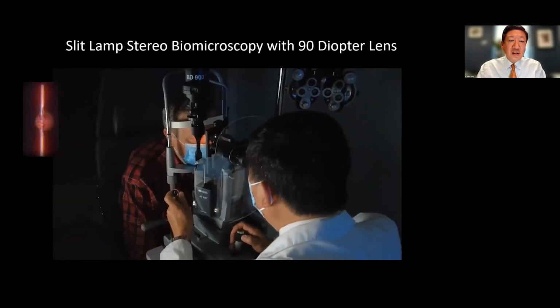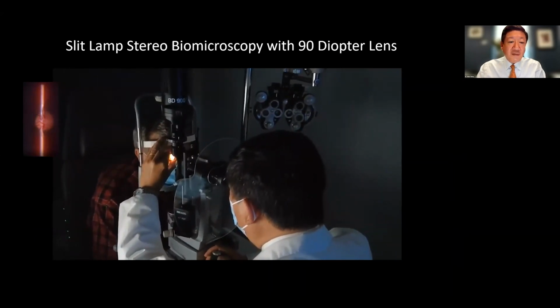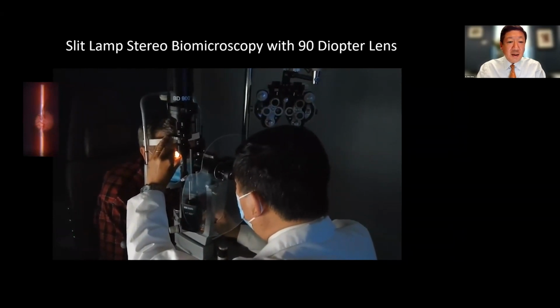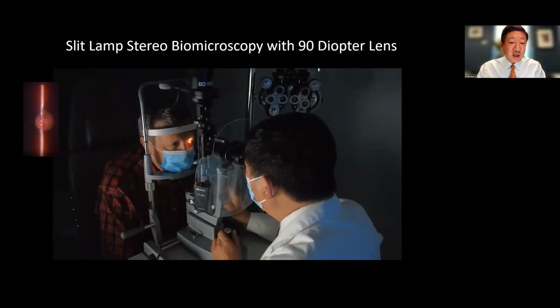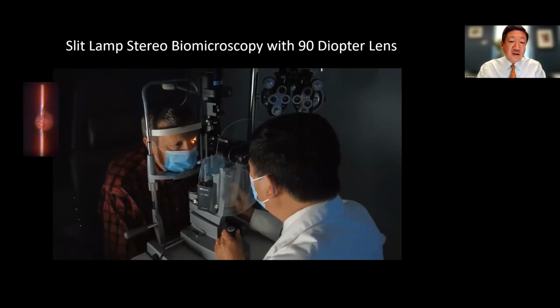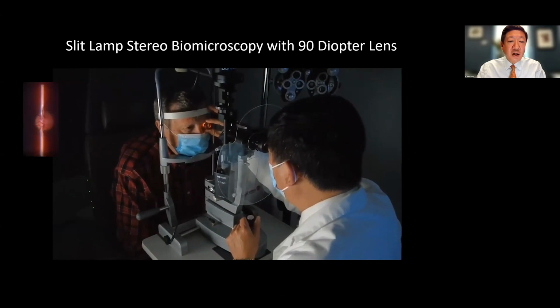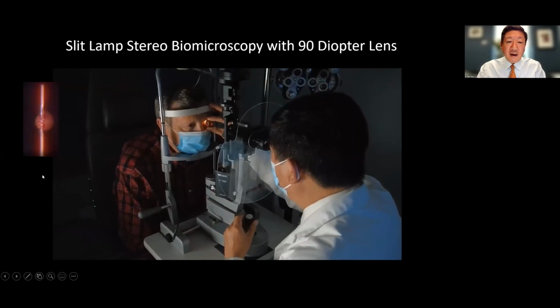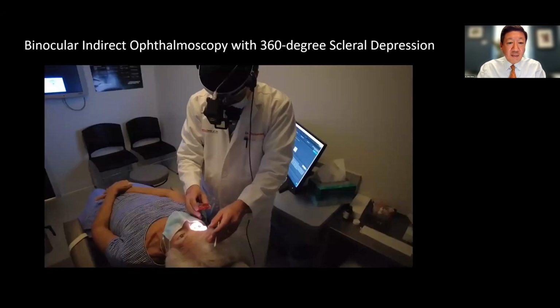Here's an example of slit lamp stereo microscopy using a 90 diopter lens. I see my left hand is rested on the forehead rest to stabilize my hand and place the lens at the proper working distance. My right hand, in this image, is on the joystick, moving it back and forth and looking at the optic nerve as shown on the upper left-hand corner here. Again, with the slit plane, we can evaluate and appreciate the cup, the disc, the shape of the eye, and look at the image in 3 dimensions.